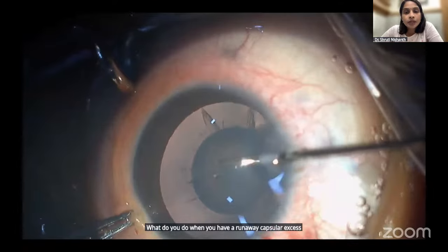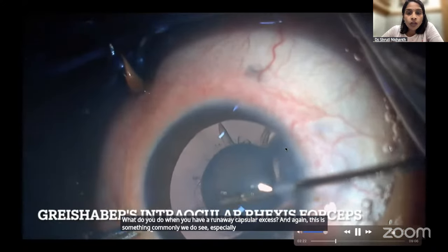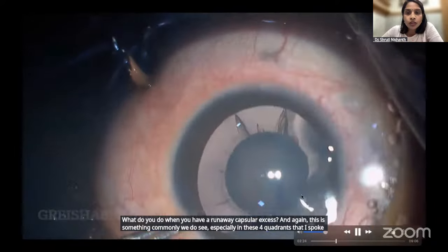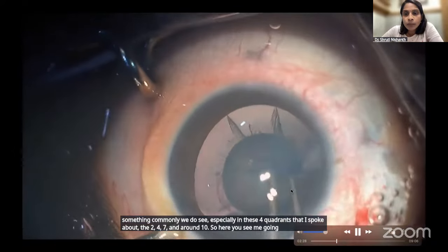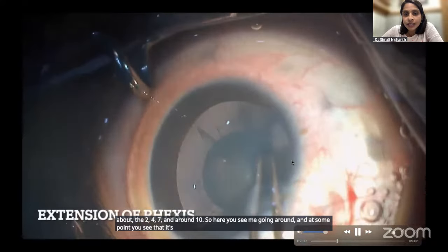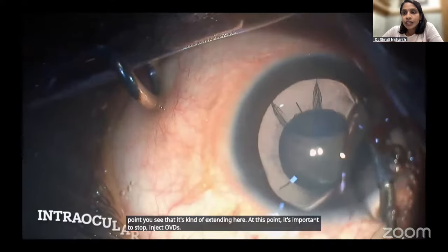Again, this is something we commonly see, especially in these 4 quadrants that I spoke about, the 2, 4, 7, and around 10. Here you see me going around, and at some point you see that it's extending here. At this point, it's important to stop, inject OVDs, and use a sharp dissection.